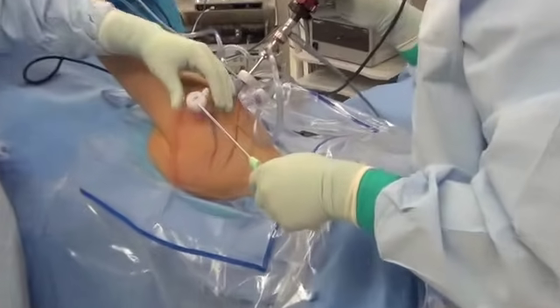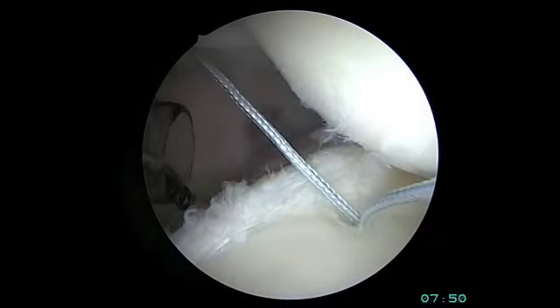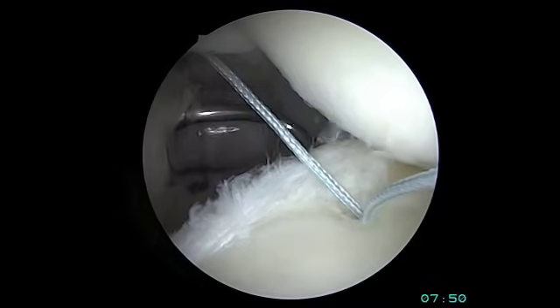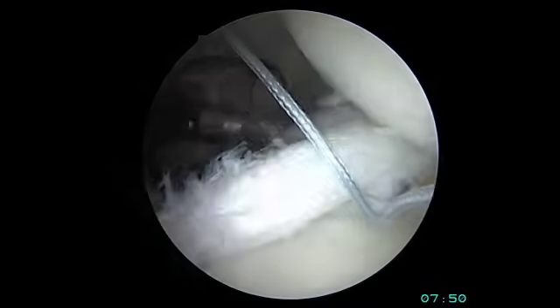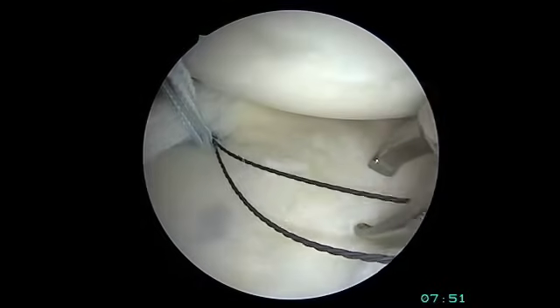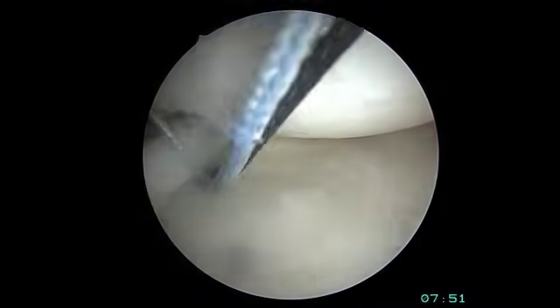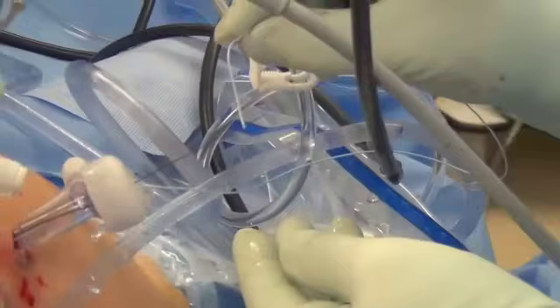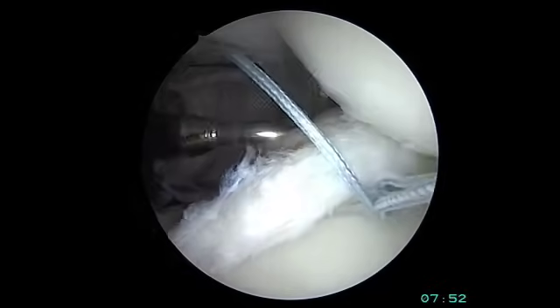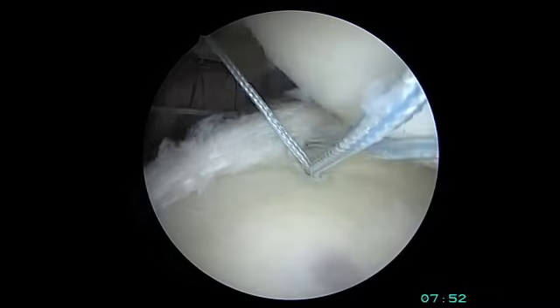The two blue sutures can now be utilized to fix the labrum. This lasso device allows us to shuttle one of the sutures through the labrum — it's sharp and has a wire loop inside. This passing device is passed through the labrum at the area of the tear. The wire loop is grasped with a suture grasping forceps from another working cannula, then the suture limb is passed through the wire loop, pulled back through the joint, underneath the torn labrum, and brought back out through the initial cannula.